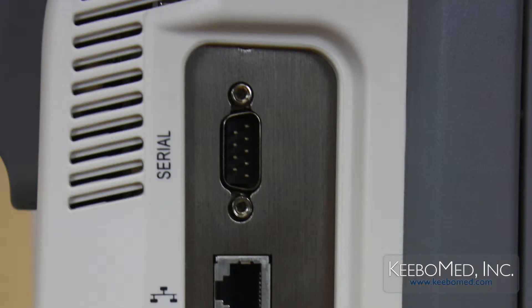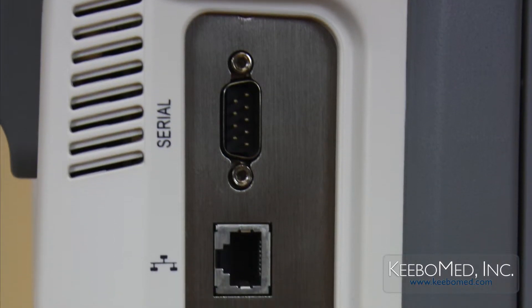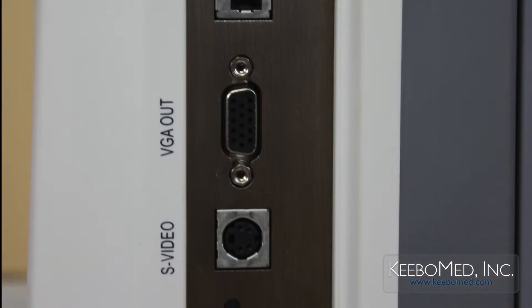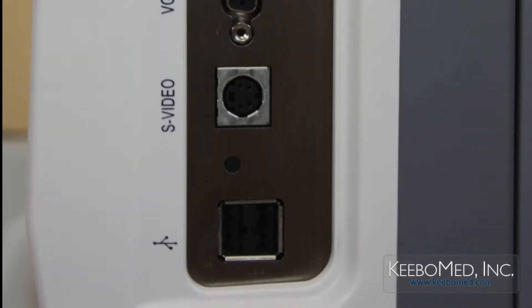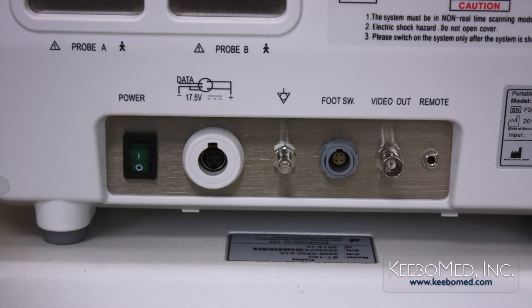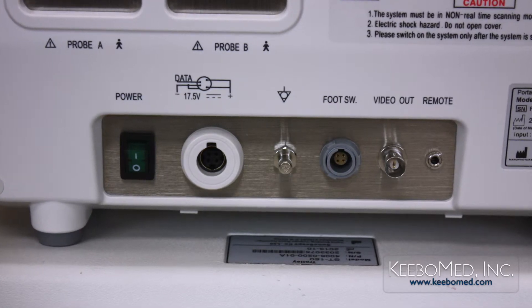The side has six ports. Starting from the top is a serial port, an ethernet port, a VGA port, an S-video port, and two USB ports.